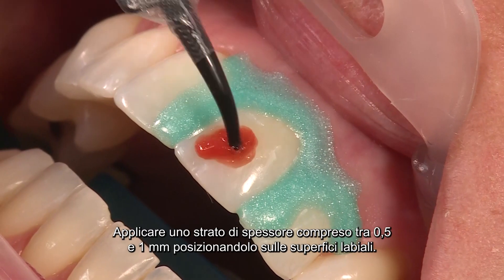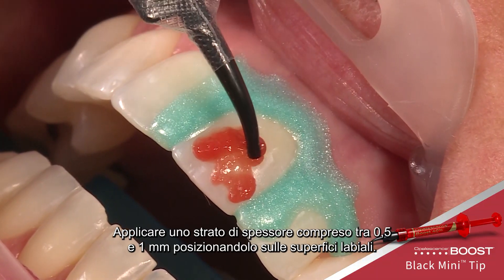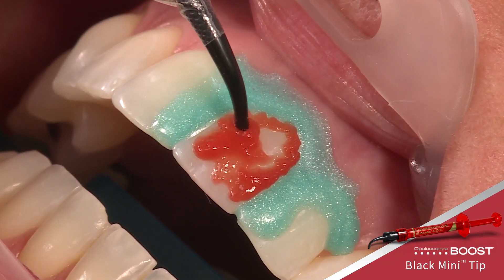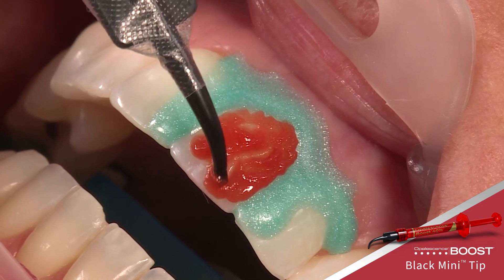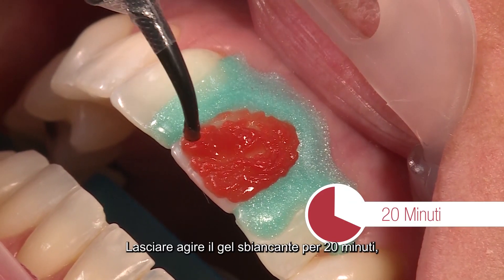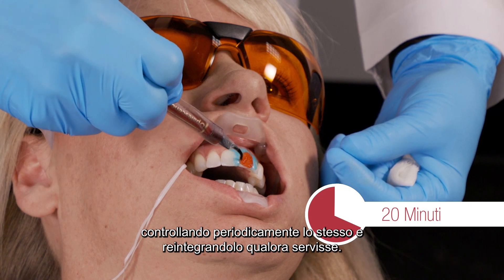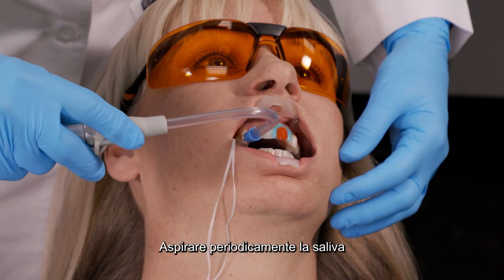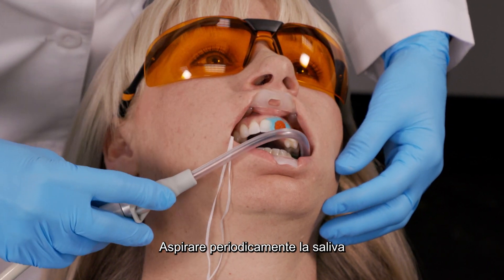Apply a 0.5 to 1 millimeter thick layer of gel over the labial surface. Allow the gel to remain on the teeth for 20 minutes, checking and reapplying the gel to areas that have thinned or need replenishing. Periodically suction saliva with a saliva ejector as needed.